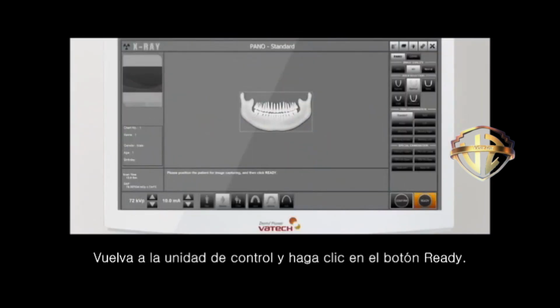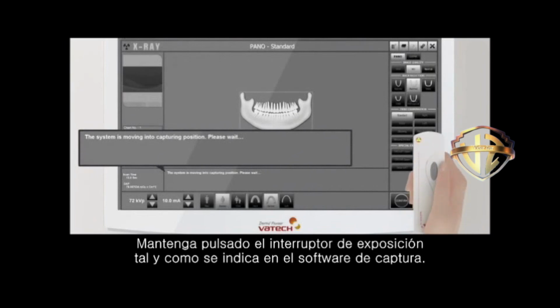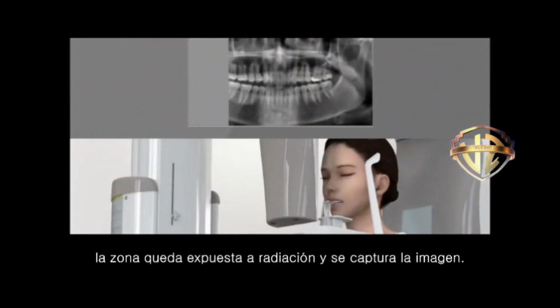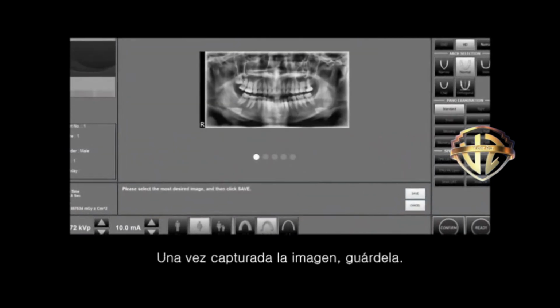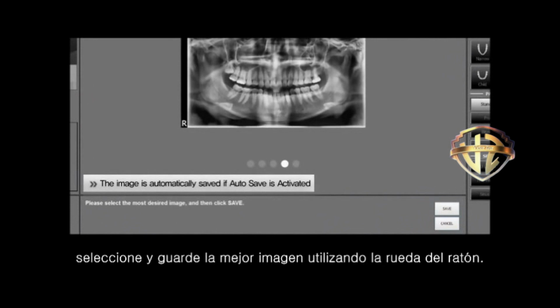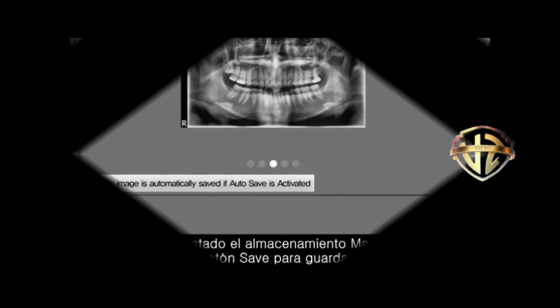Back at the control unit, click the Ready button. Press and hold the exposure switch as the guide in capture software. While the exposure switch is held, radiation is exposed and proceeds taking the images. After the image acquisition, save the captured image. If you purchased license of AF mode, select and save the optimal image using mouse wheel. If the manual save is set, click the Save button to save the image.